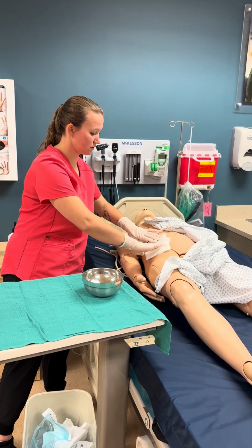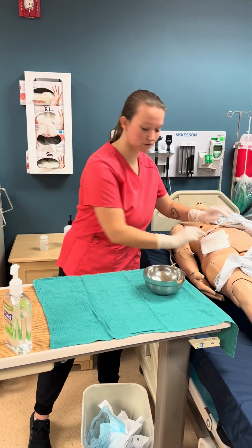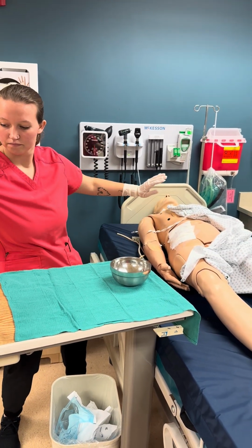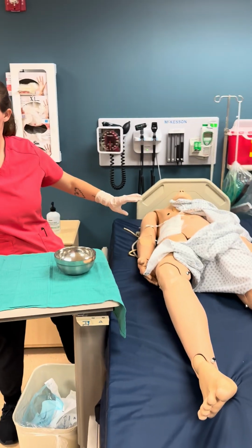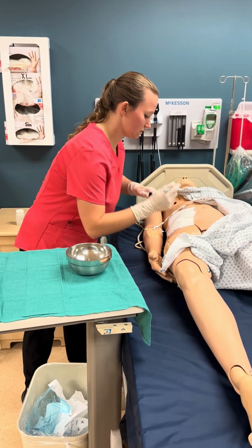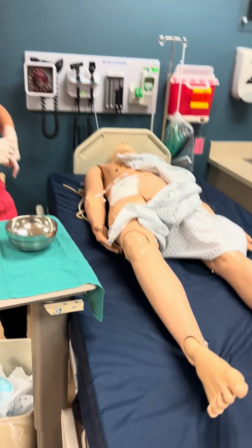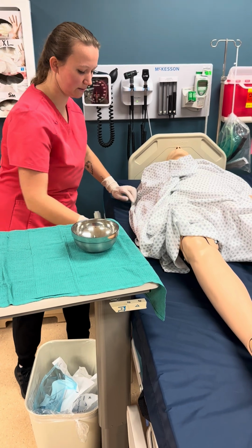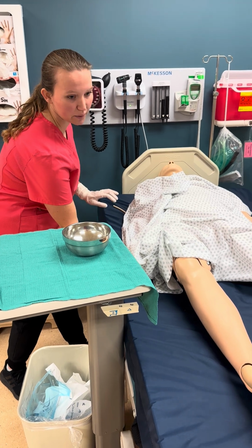I'm gonna tape it down, so I'm gonna hold that there. I'm gonna tape it down the corners. All right, still doing okay, Joe? Yep. Awesome. Let me get my last piece of tape here. Taping the corners. I'm gonna do the date, the time, and my initials. And I'm gonna get Joe nice and comfortable. All right, Joe, is there anything else I can do for you while I'm here? I have time? Nope. Okay, I'm gonna just lower him down so he's not hanging out at my waist.